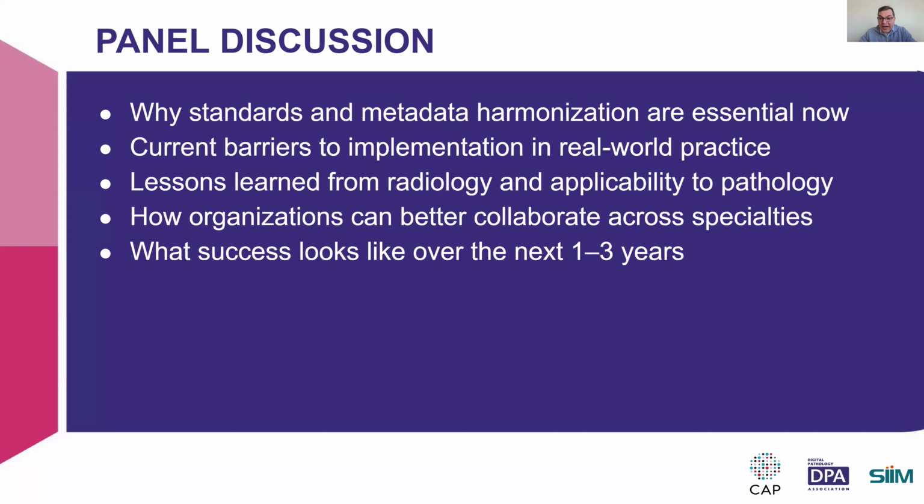What you really need to do is ask the vendor for the conformance statement and do the comparison, and also ask whether they participated in previous Connectathons and whether they have a full, validated conformance statement. These are the barriers that I saw when we went through our journey with Michigan Medicine.